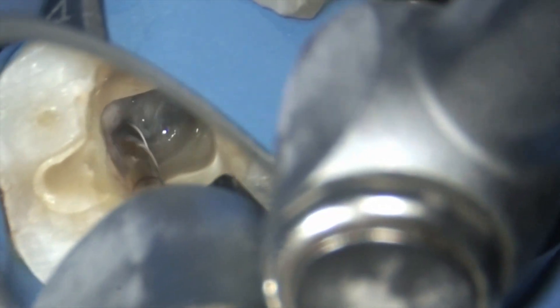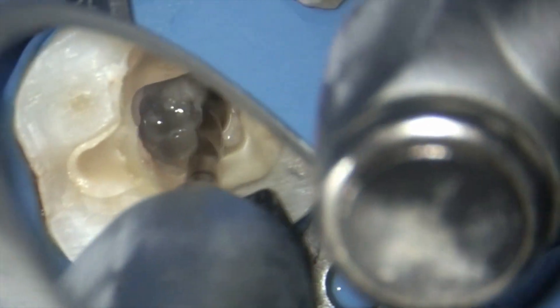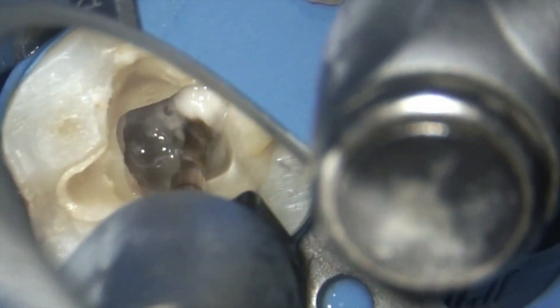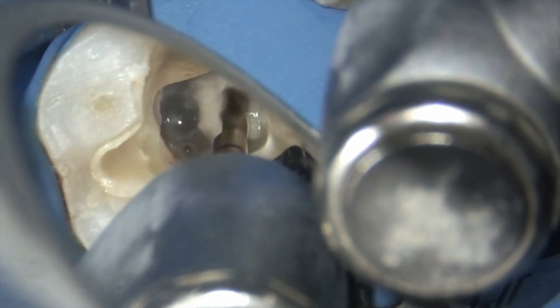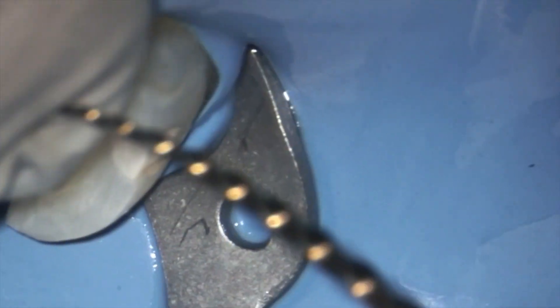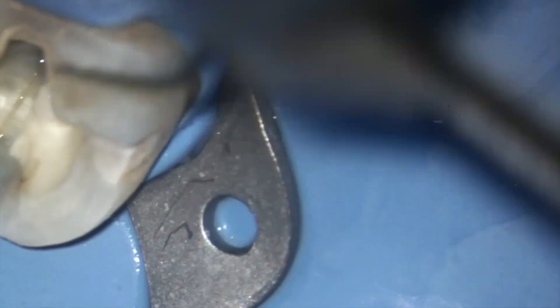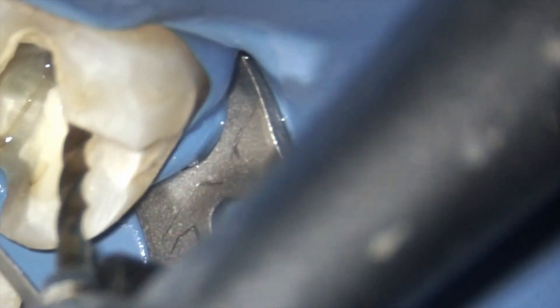Following this we use the 20/0.06 file, which has pretty good cutting efficiency owing to its triangular cross-section. It is pretty easy to reach the working length. Now I am going to instrument one of the most difficult to access canals — the mesio-buccal — when working on the right lower quadrant. You can see I pre-bent the file to easily place it into the canal.